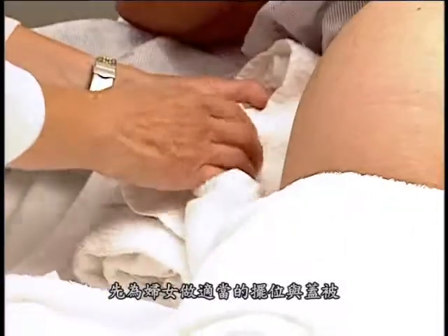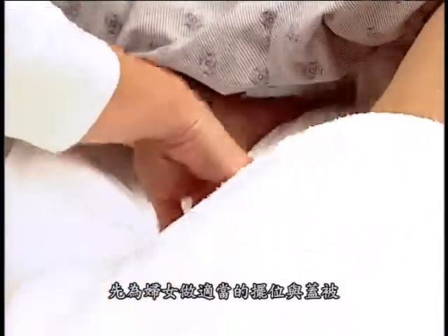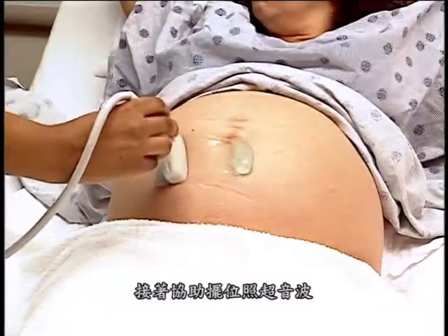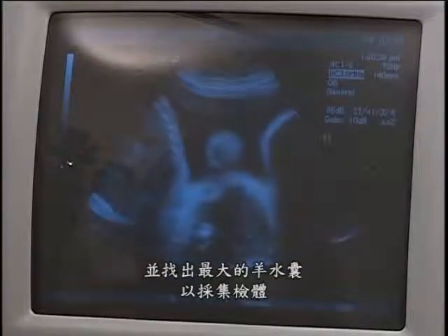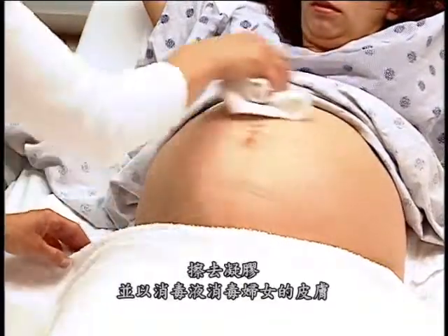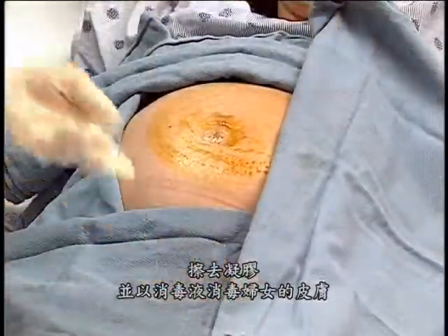When you're using amniocentesis, begin with the woman positioned and draped properly and with the necessary supplies close at hand. Then assist with positioning for ultrasonography to locate the fetus and placenta and to find the largest pockets of amniotic fluid for sampling. After the best area for sampling is located, remove the gel and prepare the woman's skin with an antiseptic solution.